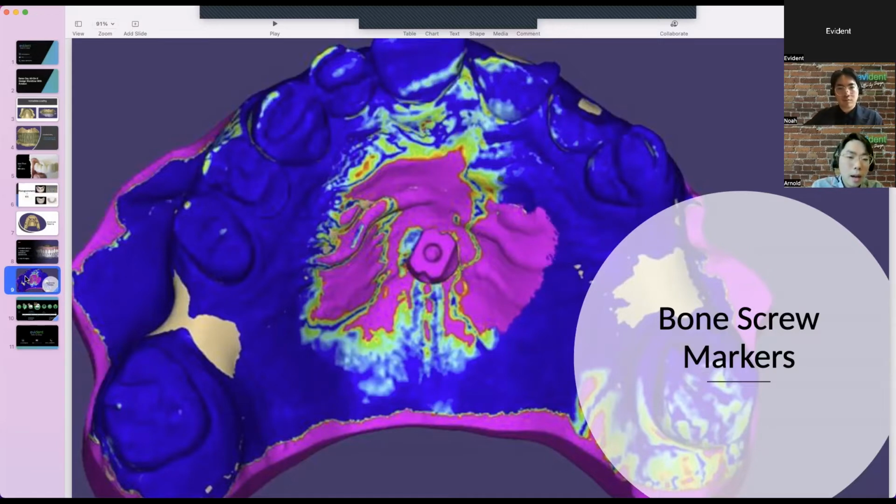Because this is how the designer will relate the original pre-op data with teeth into this new data with the teeth extracted. So they can have a tripod point to superimpose it to the correct bite record, and then we can have no issue with the bite problem when designing and when fabricating those big arches.